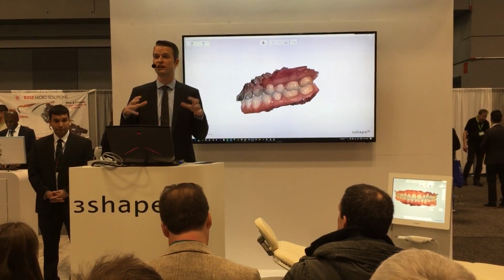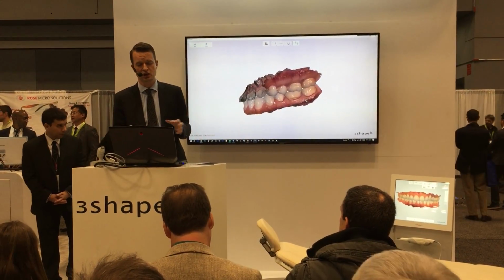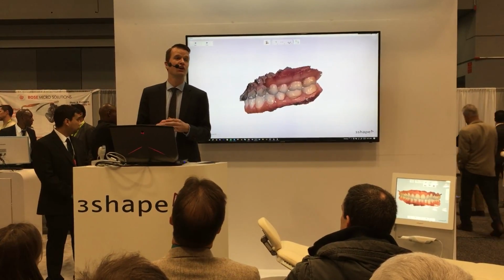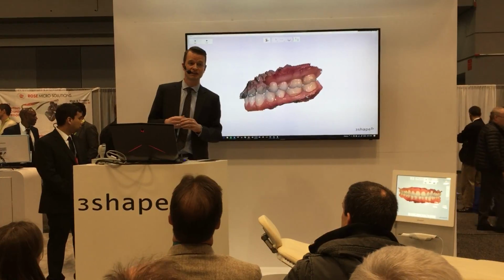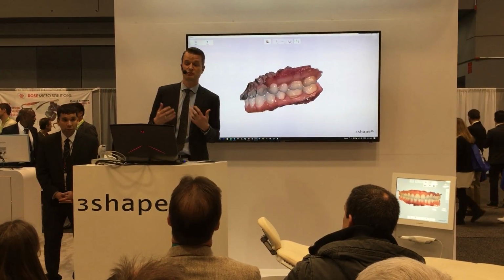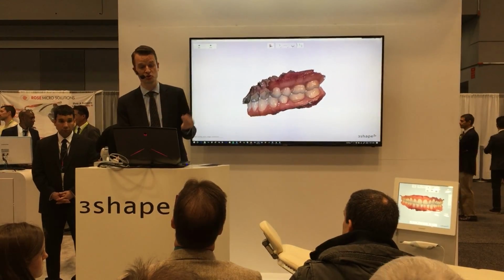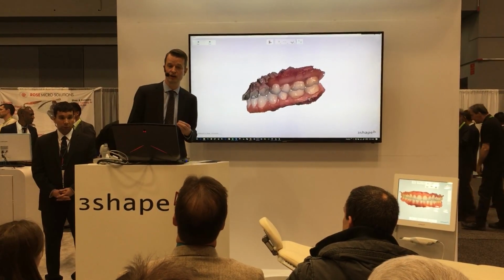And also we work on not just doing treatments with the scanner, but also looking into diagnostic opportunities and really predicting diseases, which we believe is basically radically going to change the way scanning is used, not just for treatment, but also for diagnosis.